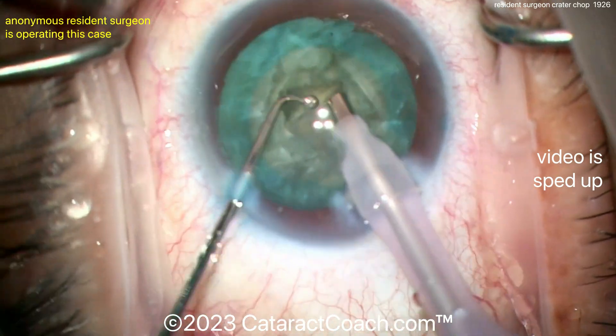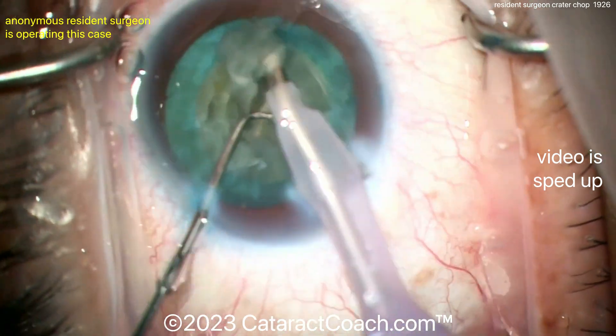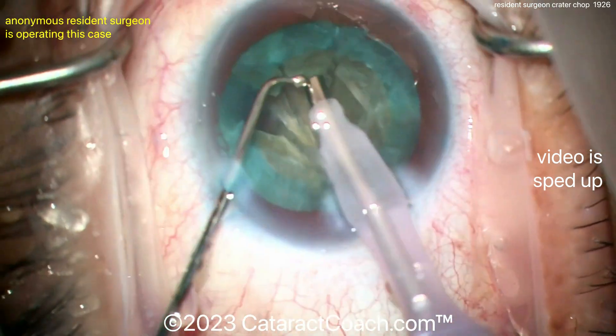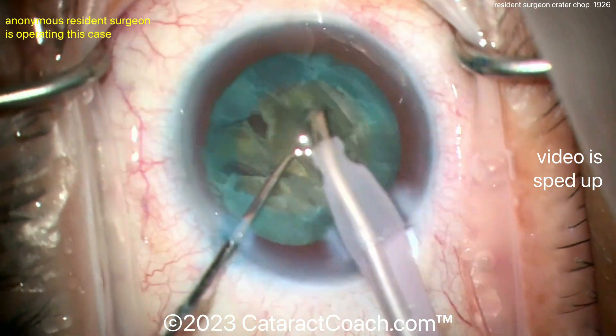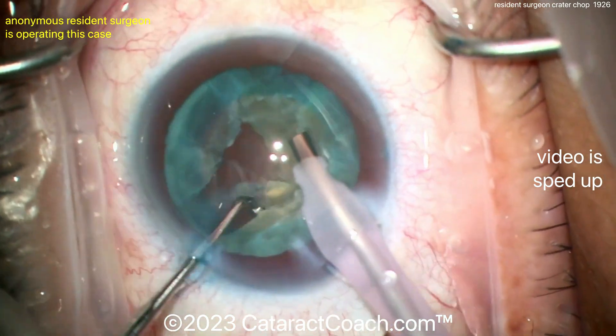Look at that — the pieces have been chopped. Now each quadrant or small piece can be emulsified pretty easily. This is a nice technique, and I encourage you to try this if you're having trouble with phaco chop.